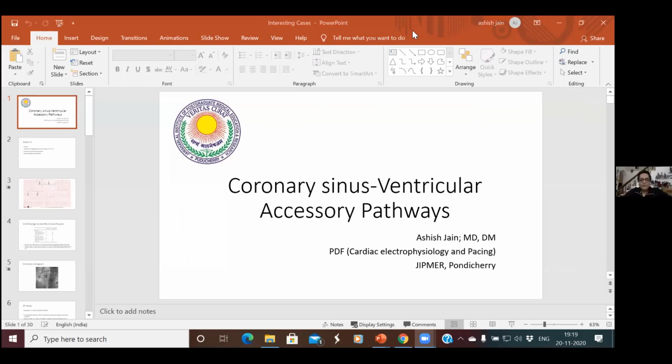I will try, sir. Okay, we've had some typical AVNRT where VA is lost after ablation without affecting antegrade. Right. And the other challenge is, if there's no VA conduction at baseline and you induce atypical AVNRT with retrograde slow pathway conduction, it's hard to do maneuvers if there's no VA conduction at baseline.